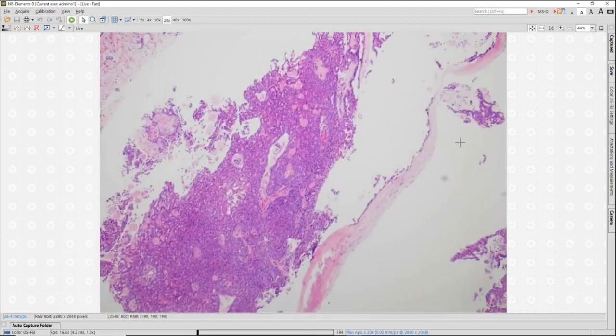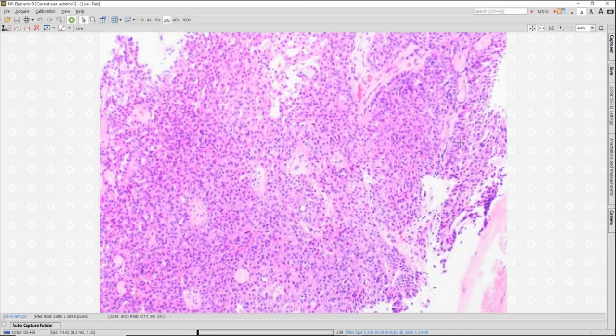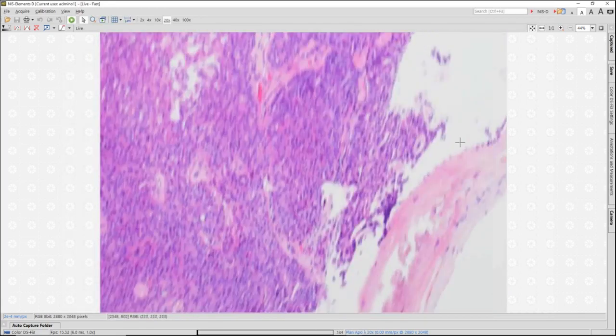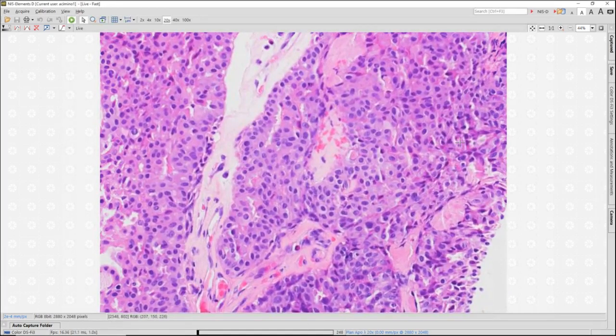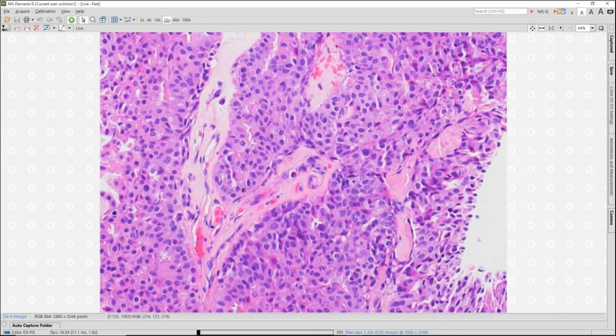As I go along the core, I notice a lot of epithelial proliferation while still maintaining those fibrovascular cores. And so we go to higher power, we're going to try and decide what exactly is this proliferation. Is it usual or is it atypical? This particular lesion, again, maintains the myoepithelial cell layer in the fibrovascular cores. I can see this outer lining layer here. This is, again, the fibrovascular core with the vessel, the small little capillary, and the fairly hyalinized pink stroma.